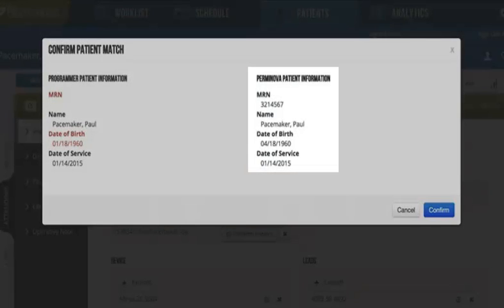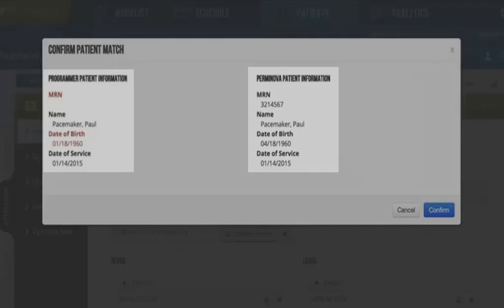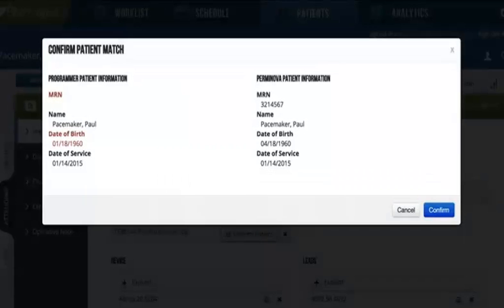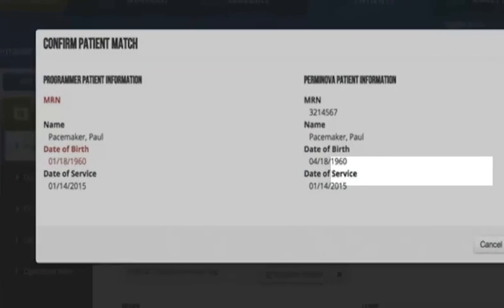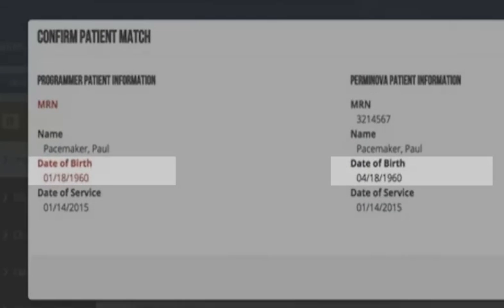Permanova will confirm the file you are uploading matches the patient record that you are charting in. Any mismatched information will be flagged red.